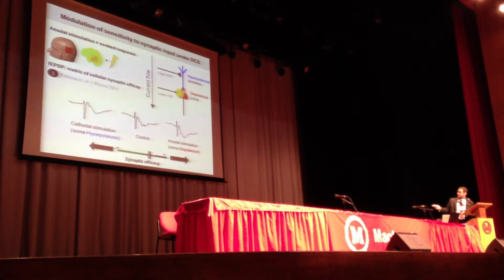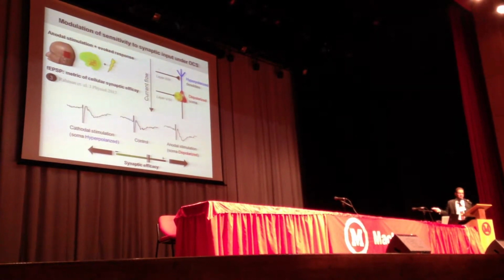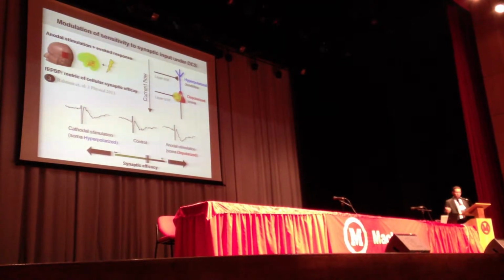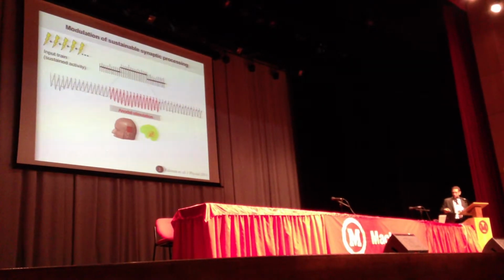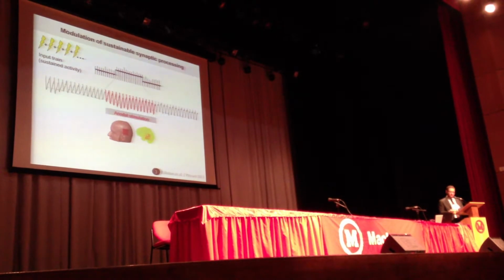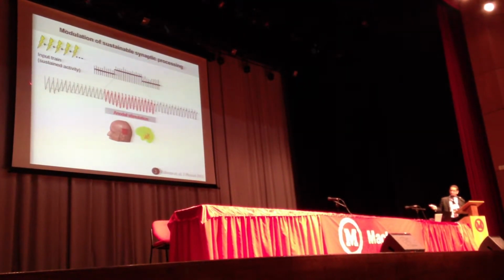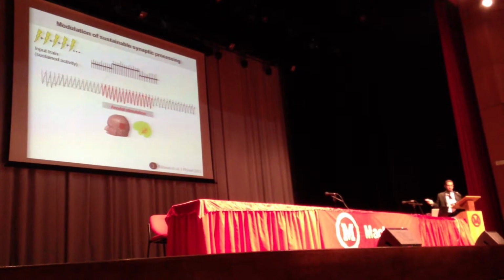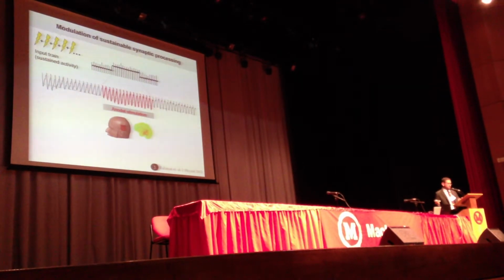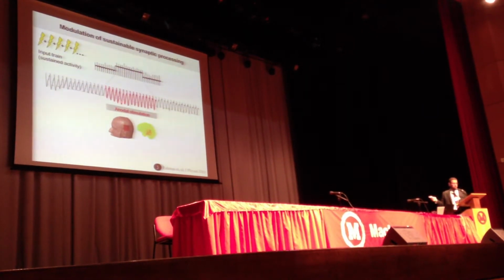And so one way to think about this is that we have a dial here. And what tDCS is doing is not making the cell fire more, it's making it more receptive to input, or it's making it less receptive to input. And I think it's useful to show a very similar experiment, but in a different context. In this case, we're applying continuous stimulation, almost like rTMS, a version of it in slice. And what we're doing is we're producing a train of EPSPs. You can see there's a response, response, response, and so on, and it keeps going. The neuron keeps responding to the synaptic input that it's receiving. It's not firing. At this point here, we've turned on the field, and we continue with this train.